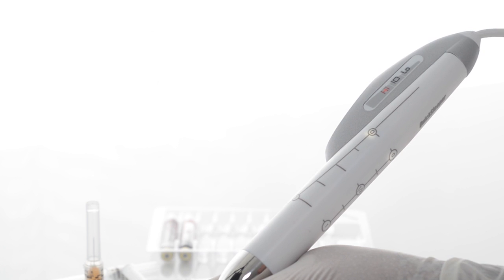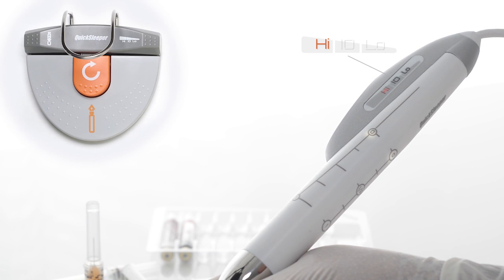QuickSleeper 5 offers three injection modes that can be selected by pressing the corresponding pedal. An indicator light on the handpiece shows the injection mode selected.